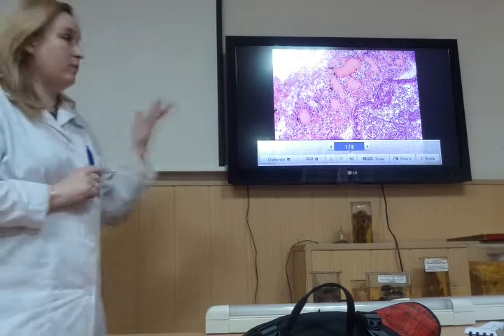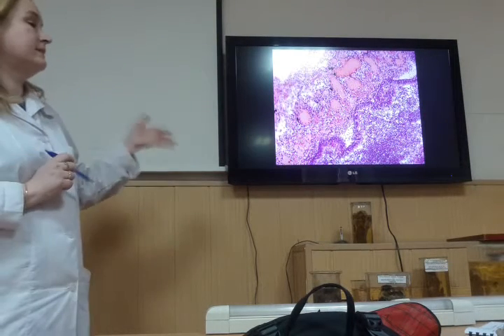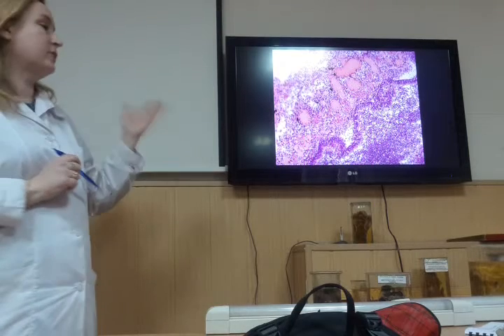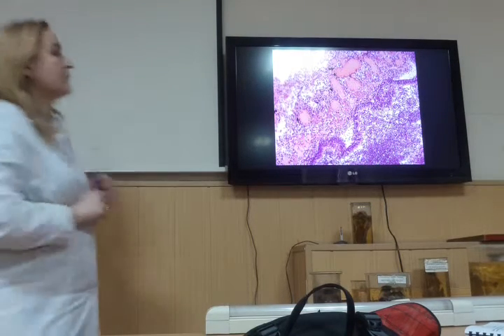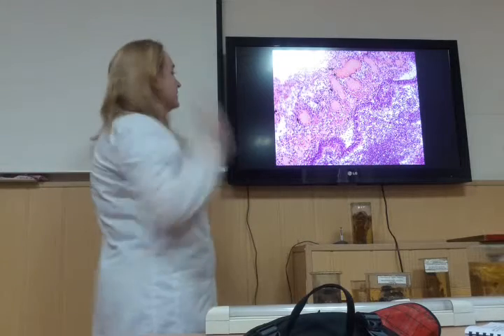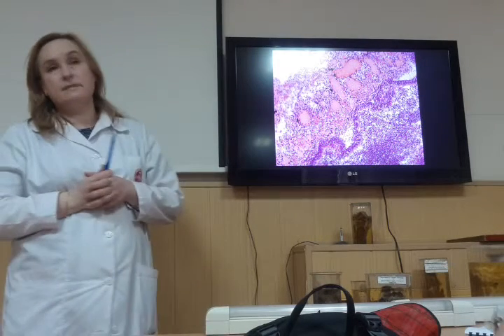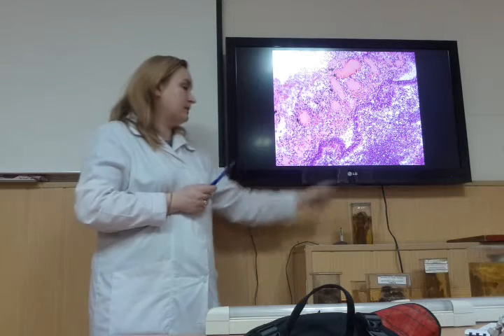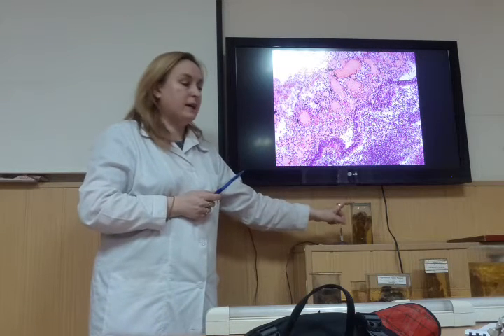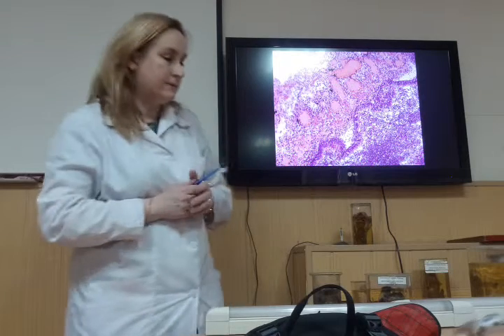The desquamation of epithelium is a very important marker of this disease. Sometimes we can see this in areas of necrosis in trachea, in bronchi, and in lung tissue too. Also, influenza viruses can cause the extravasation of blood, increased permeability of the vessels in the walls of the trachea and of the bronchi. Firstly, please describe the gross tracheitis in influenza, and then I will show you the changes in the lung in this disease.